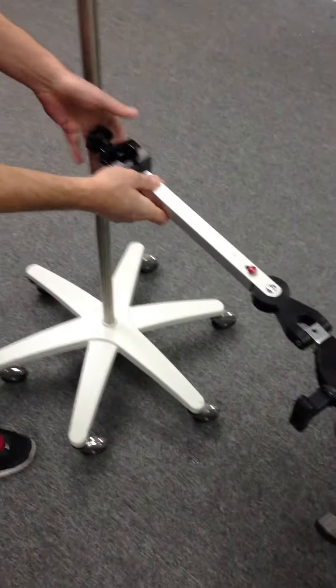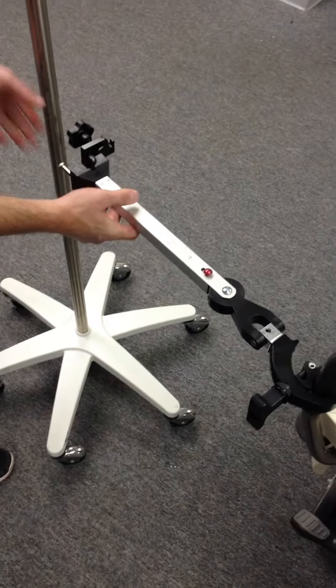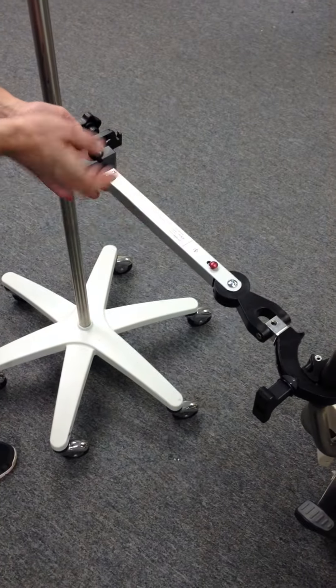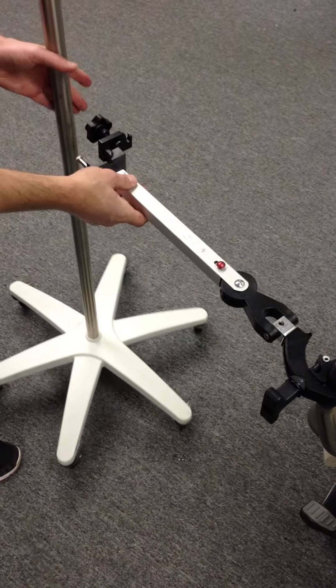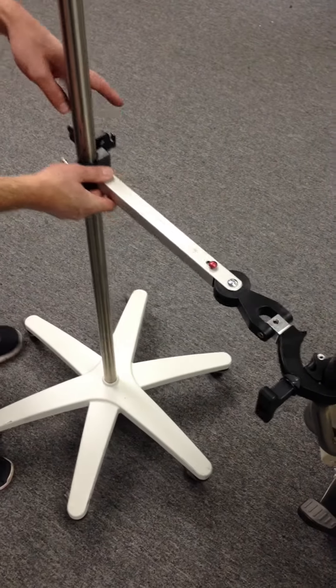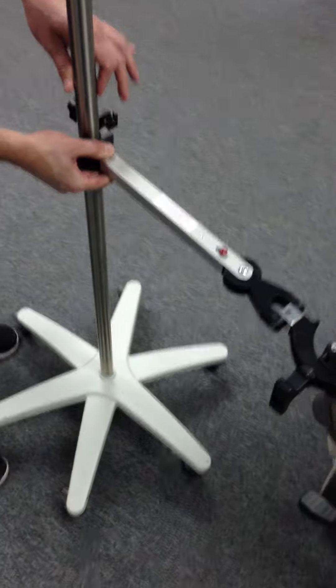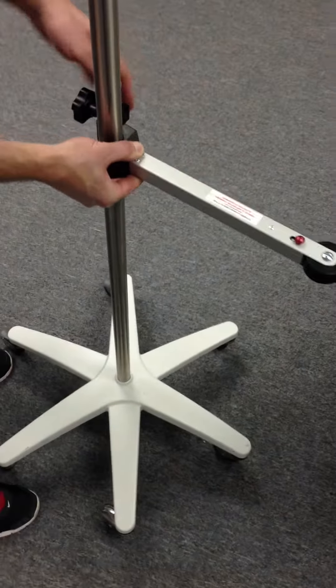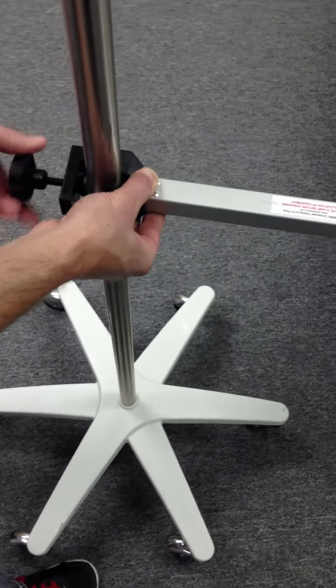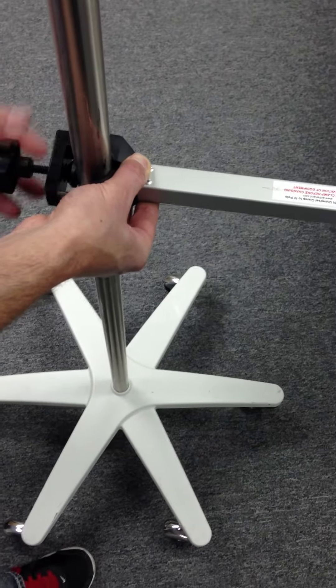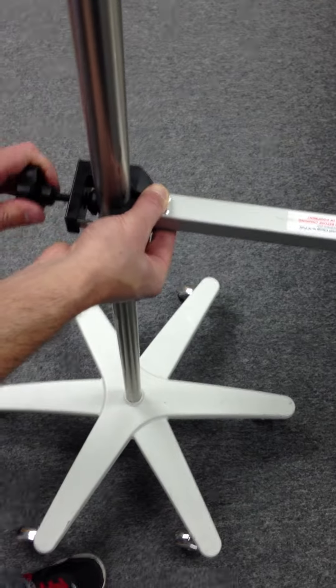Then you can attach your IV pole. Once again everything is straight in line here. Find your point where everything is flat. Tighten the handle.